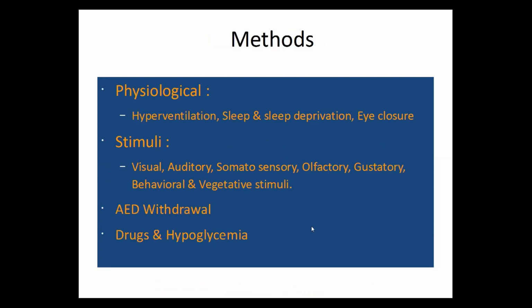The activation procedures can be simple physiological ones like hyperventilation, or something like sleep, either occurrence of sleep or making the patient sleep. In video EEG the patient will definitely go into normal sleep, so we'll get activation of various abnormalities during normal sleep also.